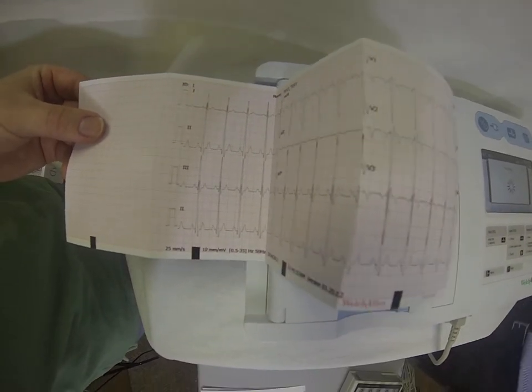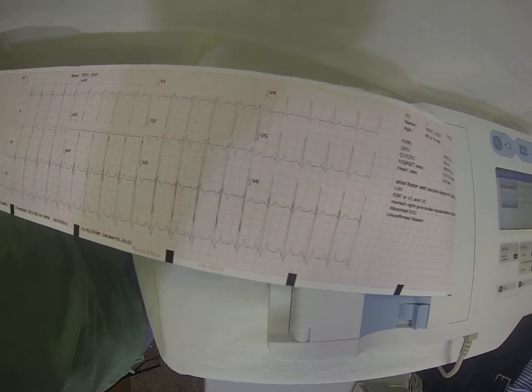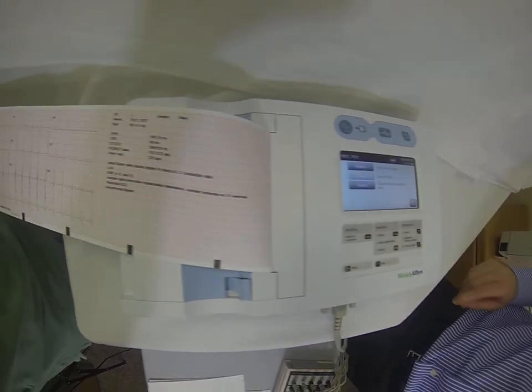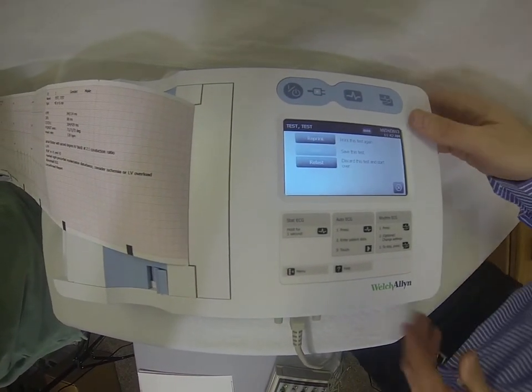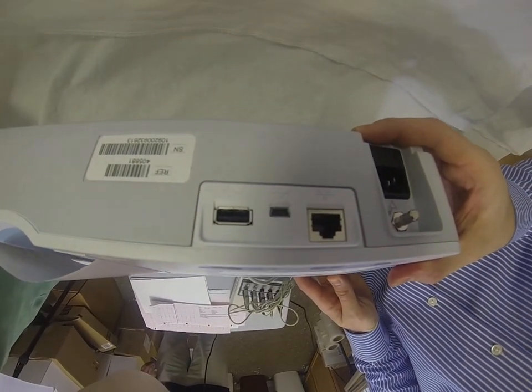It will also give you the patient information and interpretation. The CP50 has the ability to store 50 tests locally, or you can also use the USB ports in the back here to store them to a USB stick if you'd like.